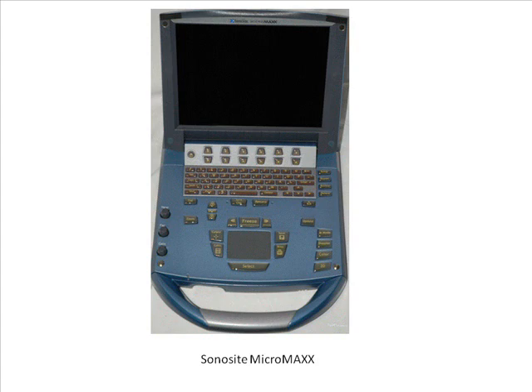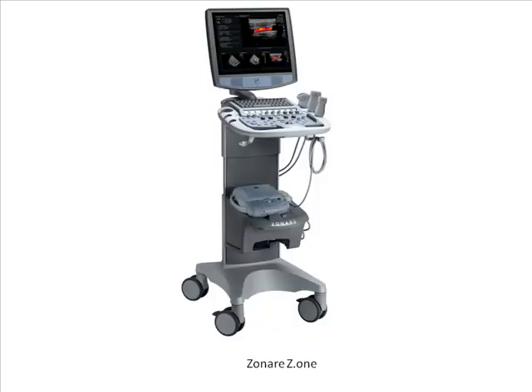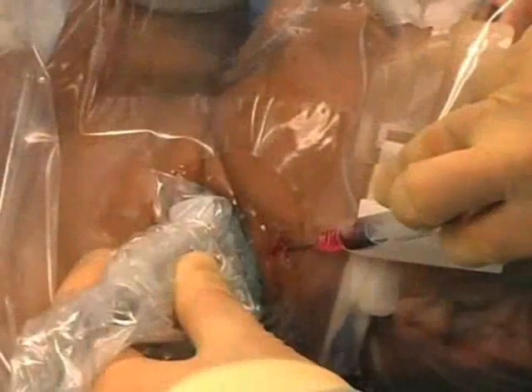There are various types of ultrasound machines available at UCSD, such as the Sonosite, this GE Logiq E, and the Zonare. These all basically have the same type of controls, but the layout may be different. Part 1 of this video will talk about how to use ultrasound for central line insertion.